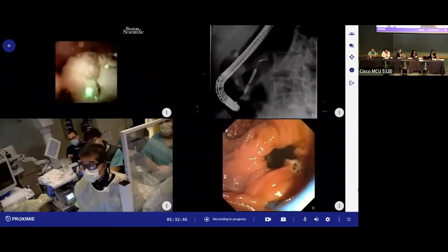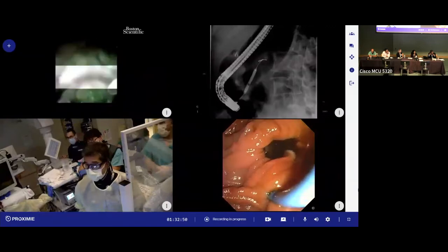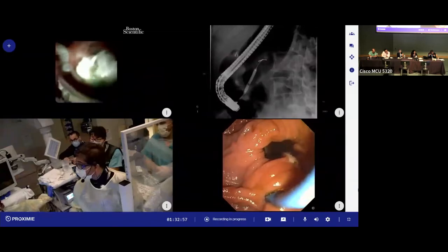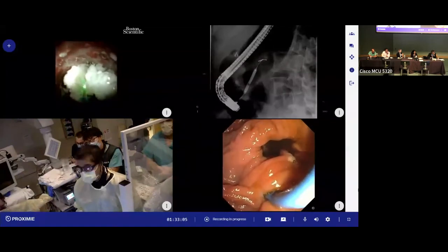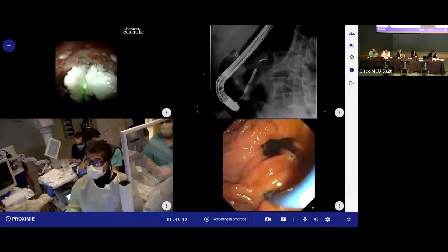Oh yeah, go ahead. So when you were slicing the scar tissue, do you have a typical approach in terms of how many quadrants you want to cut into? Should we turn it up? Do you do 4 or 6 incisions? What's your typical approach to that? I try to do 3 quadrants, ideally 4, but it's hard to get a 4th quadrant. And so I will do gentle pressure starting at about 4 watts, which is what we did.